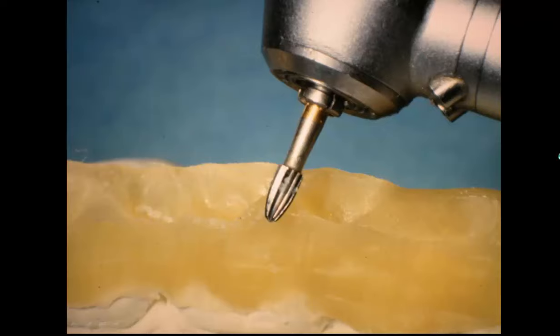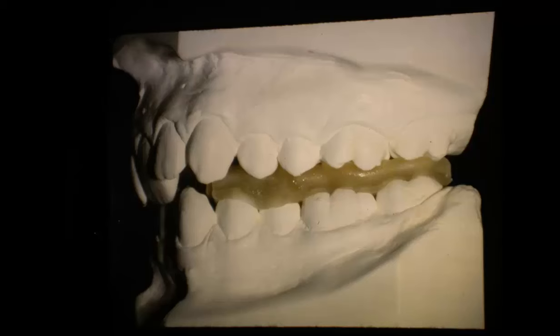Now, after we trim that off, you can try it back again when they move the jaw around. This is just showing the model of the actual guy's teeth right here and how we bonded that. You could start off and make them primarily from off the model if you wanted to, and then make sure you don't have any plaster in under it, and then bond it to the teeth later, but not have them come close down on it anyway.